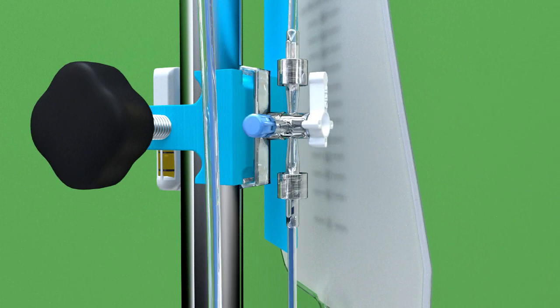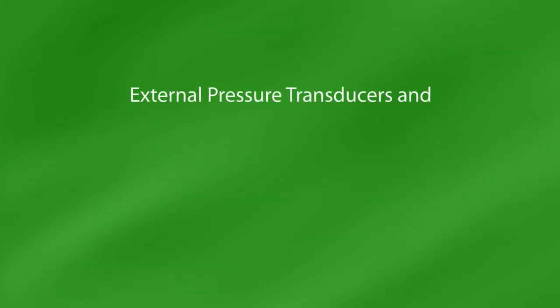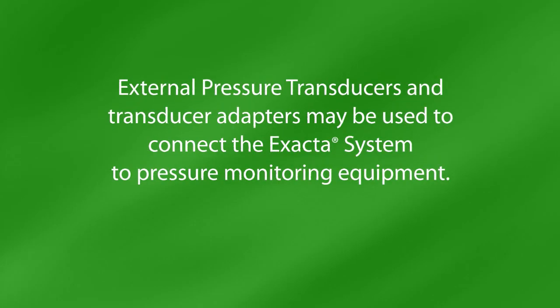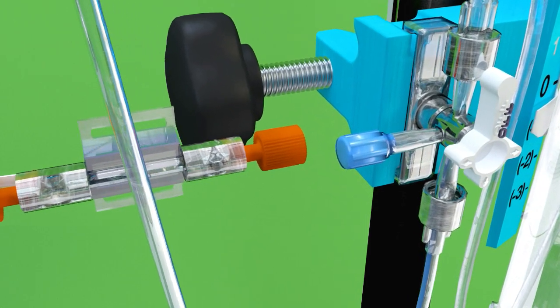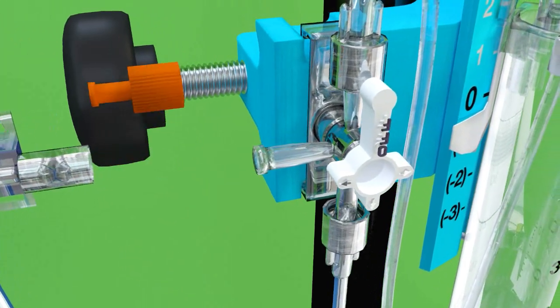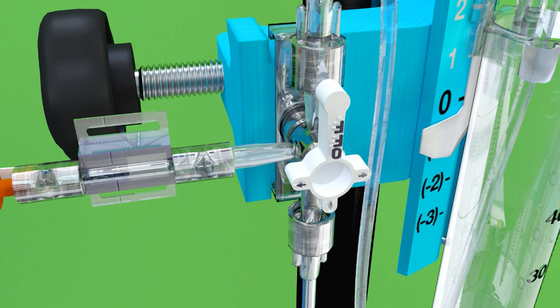Clip the main system zero-reference stopcock to the zero-reference mount on the pole clamp assembly. External pressure transducers and transducer adapters may be used to connect the Xacta system to pressure monitoring equipment. To attach the transducer adapter, remove the blue cap from the main system stopcock. Attach the transducer adapter to the main system stopcock and follow instructions supplied by the transducer manufacturer.